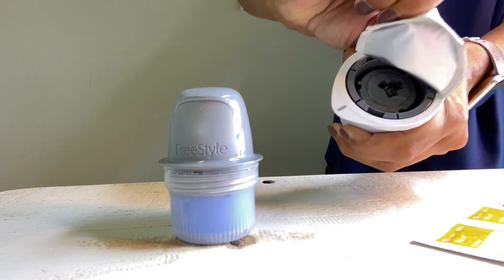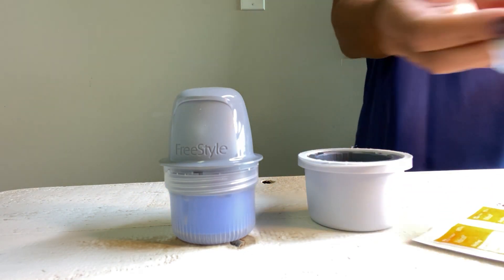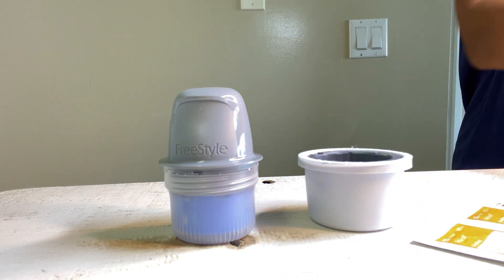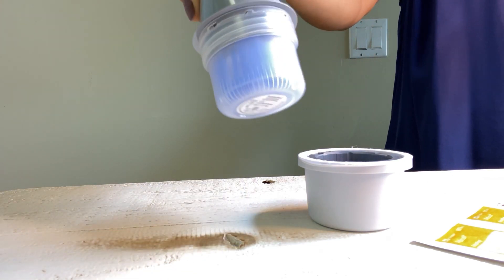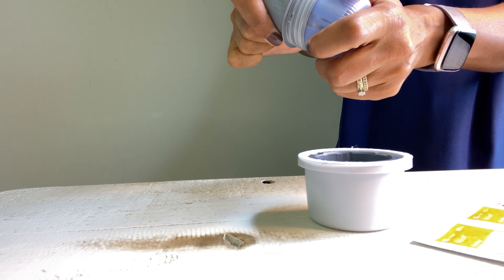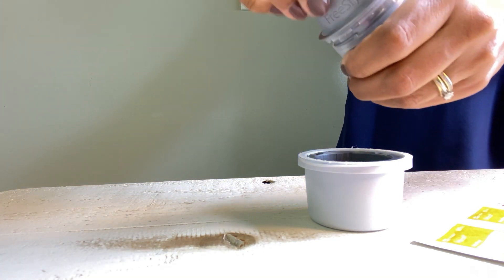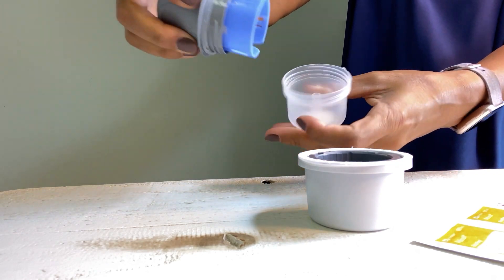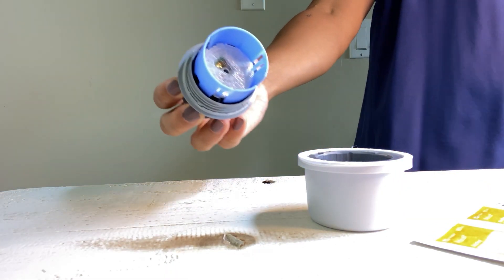You need a little finger strength here — peel that completely off and set it aside. Then you want to unscrew the cap from the sensor applicator. This is the sensor applicator and this is the cap, so we're going to unscrew that. Set that aside as well — you can actually see the sensor in there.